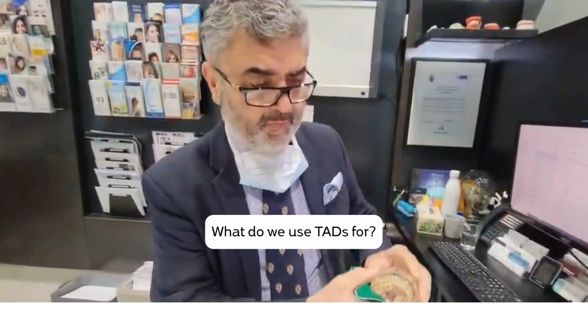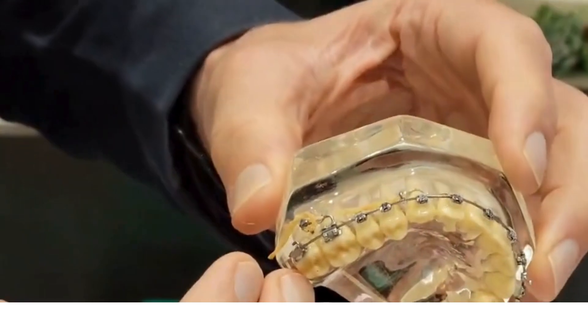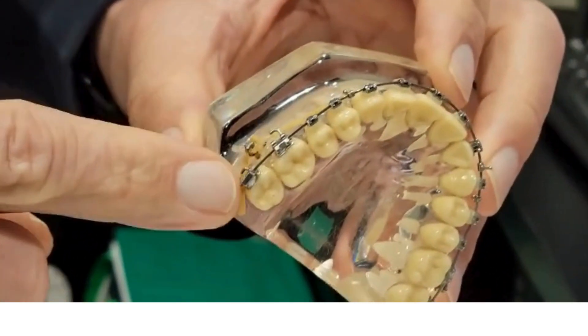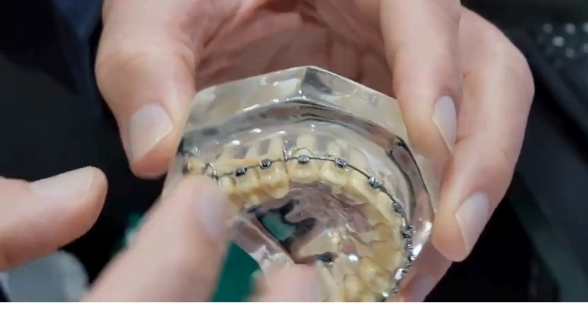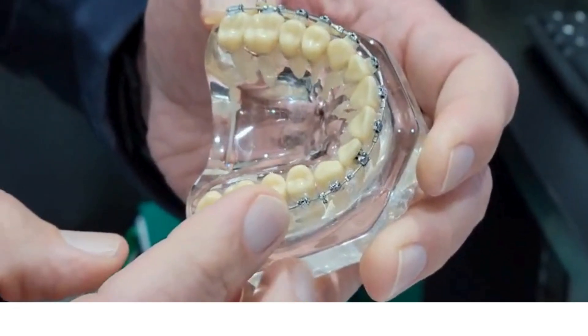What do we use TADs for? When we need to move blocks of teeth, we place the TAD between the roots of the teeth, and then using an elastic we're able to move a unit of teeth rather than just one or two at a time.